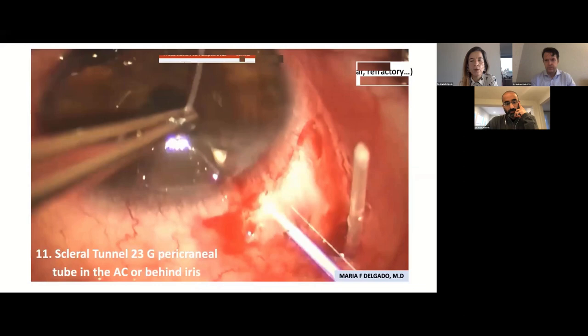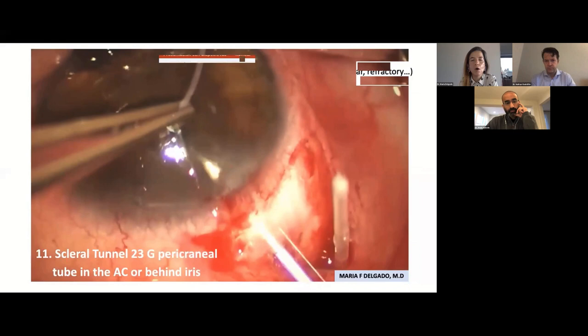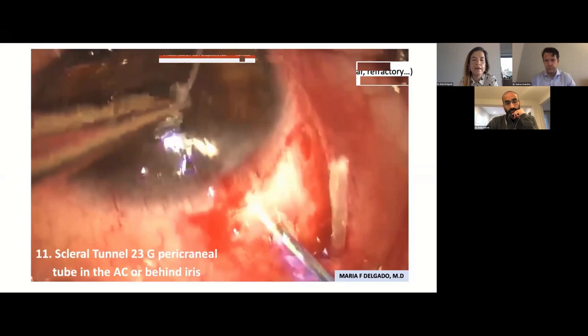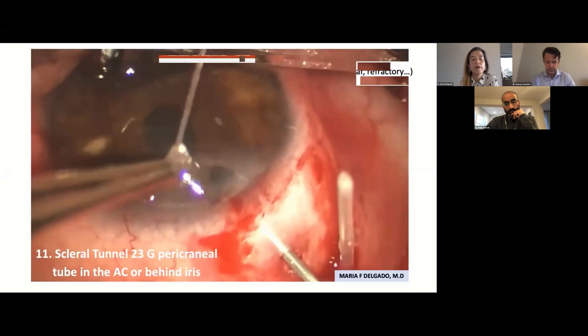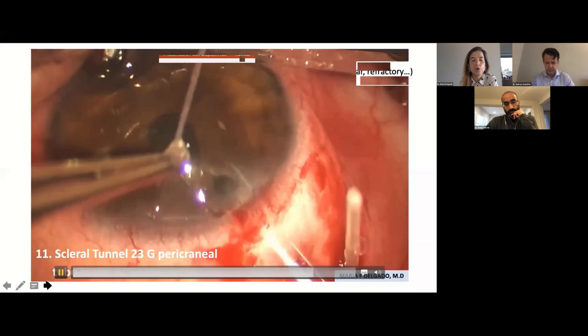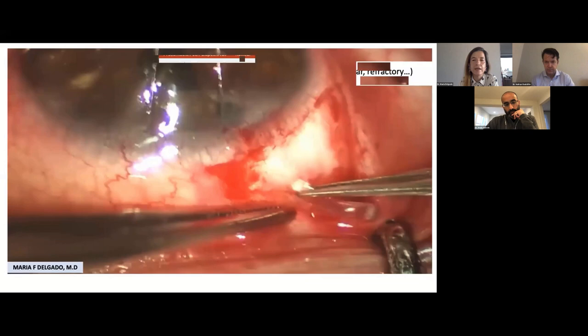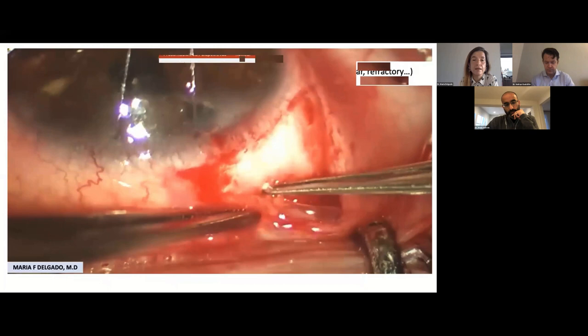So when you're perforating here, we're doing a very short eye. And as you see, I'm opening with the needle. I'm going behind, I'm going through the sulcus, but opening a closed iridectomy from his previous surgery, because I want that iridectomy open, not only for opening it, but also to see my tube, which I wanted to go through the tunnel and insinuate. I'm going to show you here before you go with your video, because I want to try to put the tube in and make it come out through that opening, just to see it, and then you see how it magically perfectly goes like that.